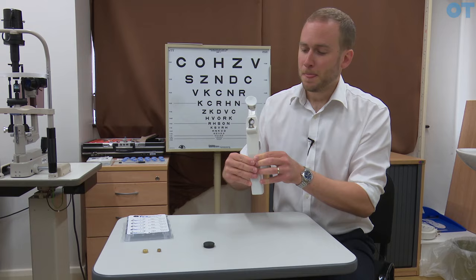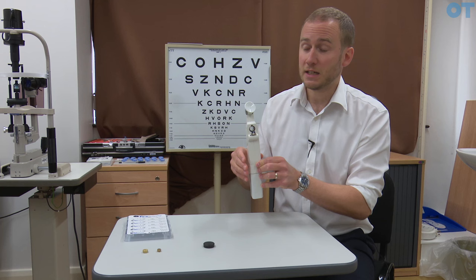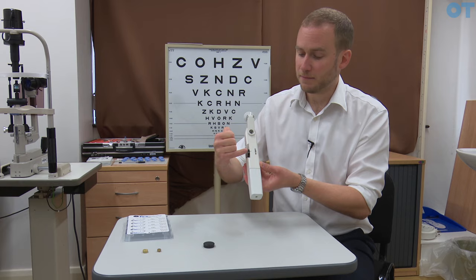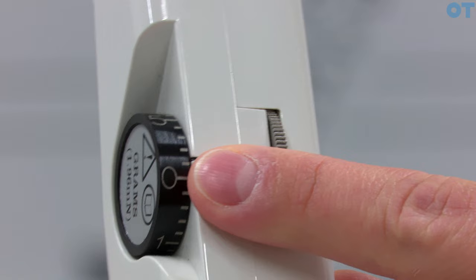If we turn the instrument around we can see a sight hole. This is where the practitioner looks through in order to see the probe. Below that we have two light sources — these are cobalt blue filters because we're going to use fluorescein, so we need that to excite the fluorescein. If we turn the instrument around again we can see two drums. The first one, which has teeth on, is where you would place your thumb or finger in order to change the pressure dial.